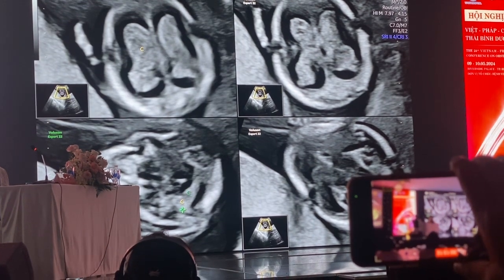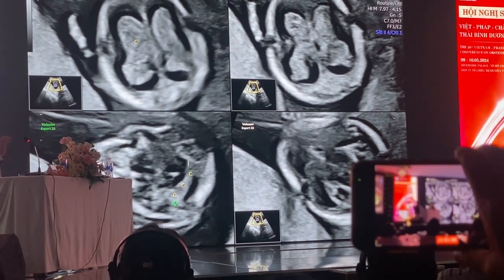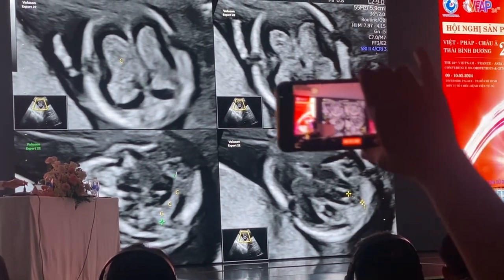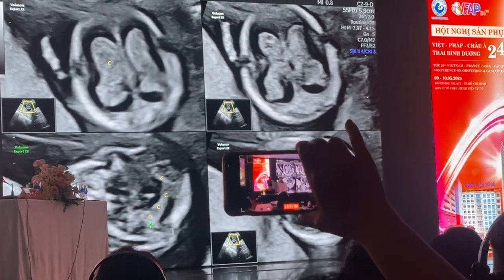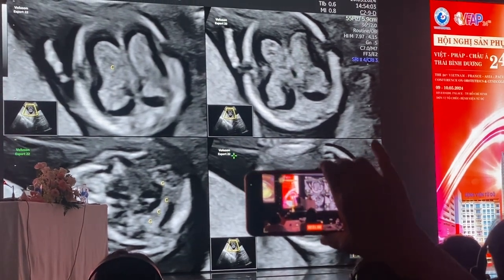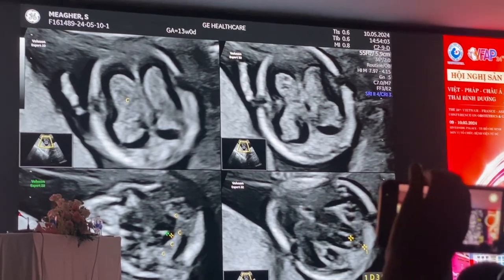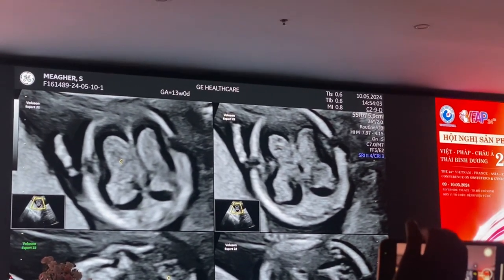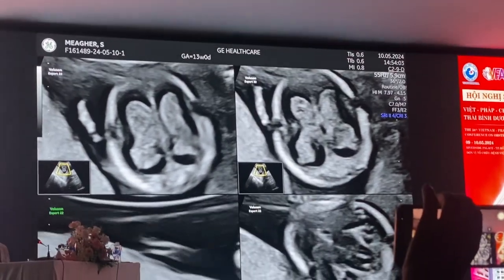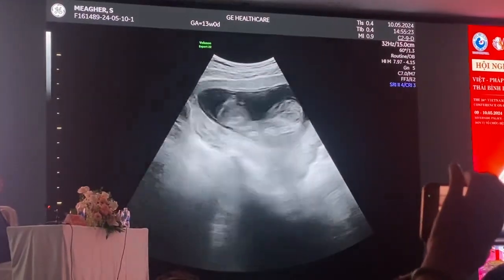There's a nice paper written by Valdo Sepulveda, and another paper subsequent to that saying if the choroid is absent, it has a strong association with posterior fossa anomalies, spinal defects, and extra-CNS malformation. And this is the intracranial translucency, which you're measuring in an axial section. So that's the analysis of the baby's brain.